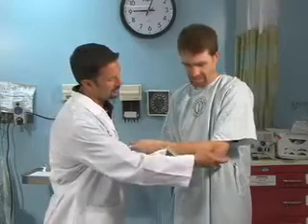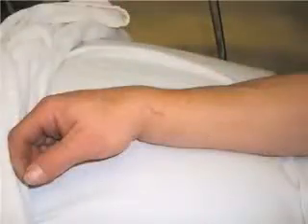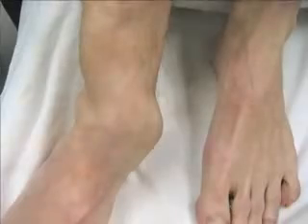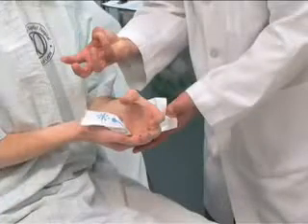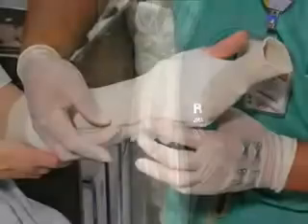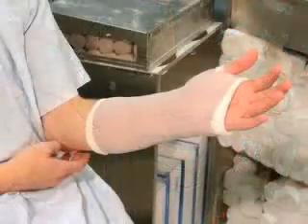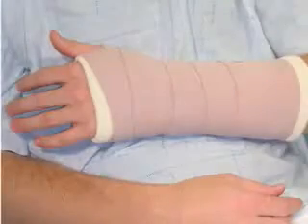Patients frequently present to primary care offices, urgent care, and emergency departments with musculoskeletal injuries such as fractures, sprains, and dislocations. Many distal extremity injuries can be initially managed in an outpatient setting using basic splinting techniques. Splinting immobilizes injured extremities and prevents further injury, decreases pain and bleeding, and allows healing to begin.